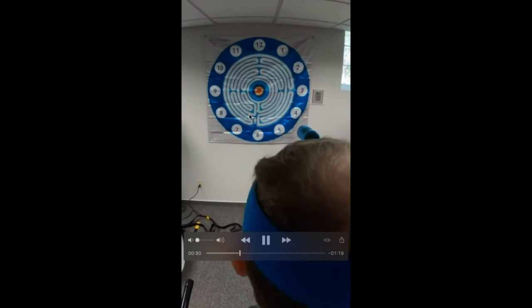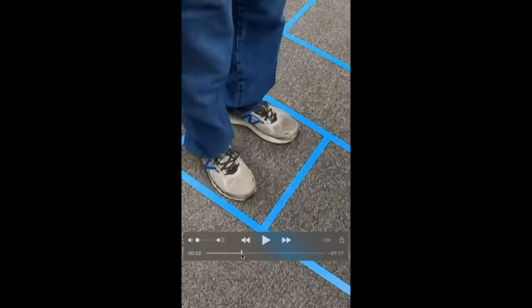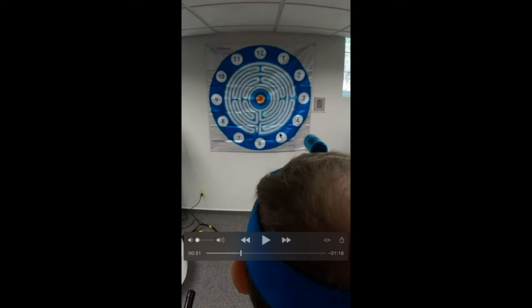So what I am seeing personally, if I pause this for a second and just give a little bit of extra input, with my orthostatic tremor, she didn't want her video up here, so I respected that. But with the orthostatic tremor that I'm seeing, my patient that has just a basal ganglia issue, but it's much less common than Parkinsonianism, but it's not Parkinson's disease, is moving through the maze.